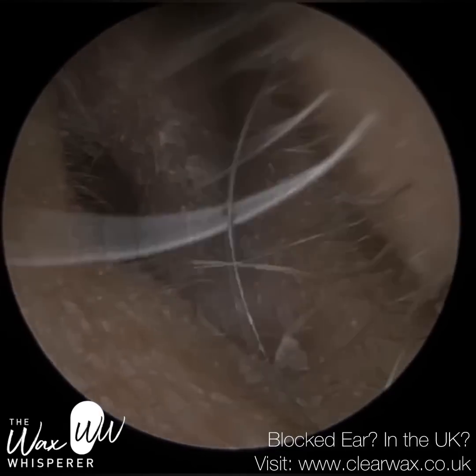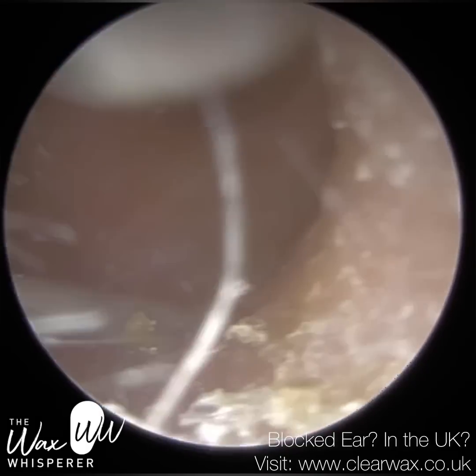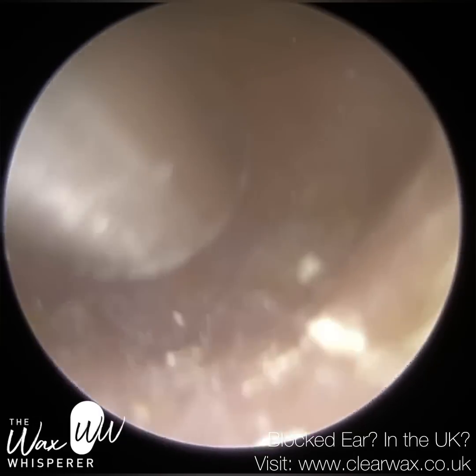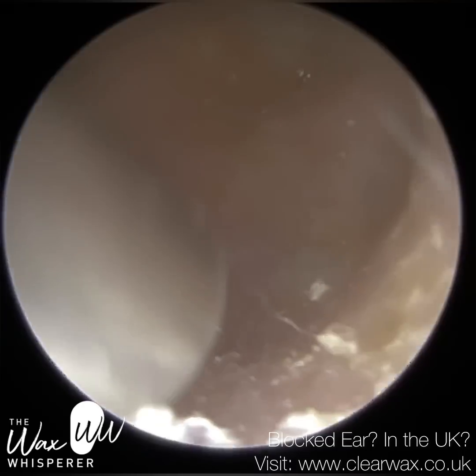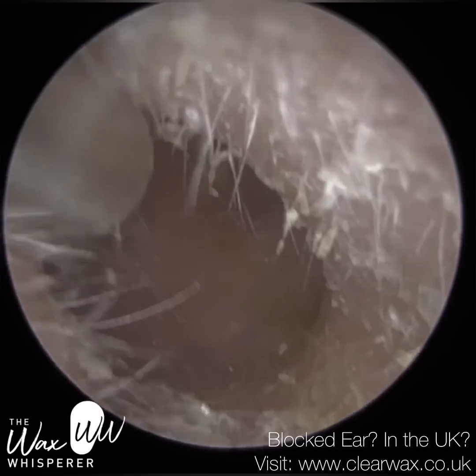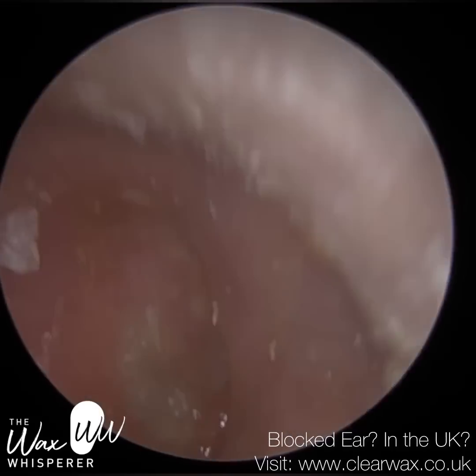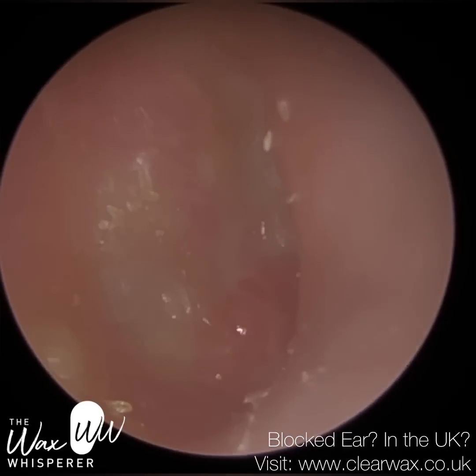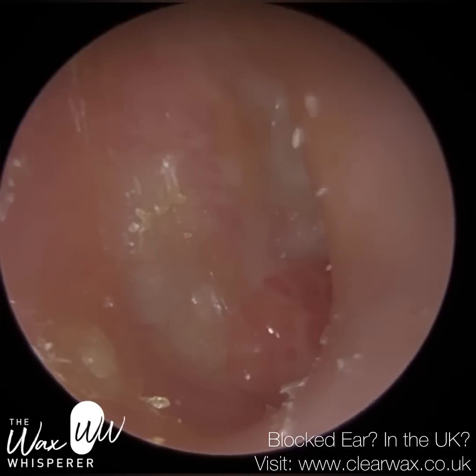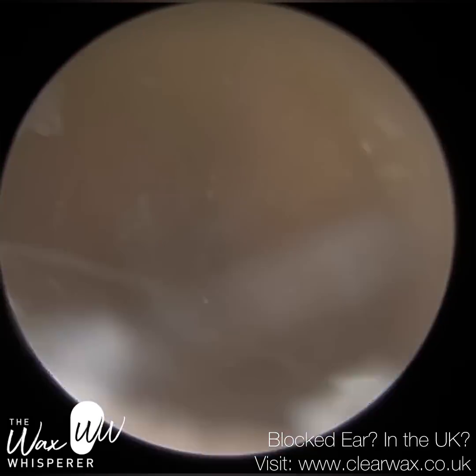So this is more really external part of the ear. Just a bit of keratin here. I'm just going to mop that out. You can see there's no trauma caused to the ear canal. It looks really healthy. Of course, you're going to get bits and bobs here and there. I've just used that suction there, not to remove anything, but just to demist the camera so I can really see what's going on.